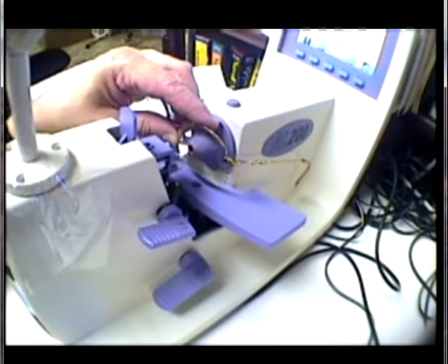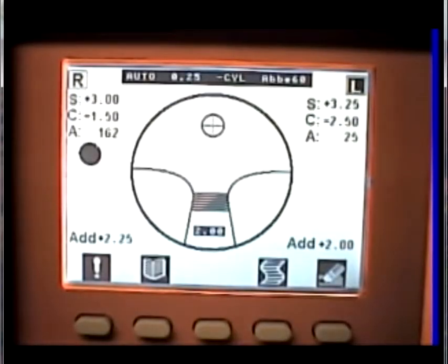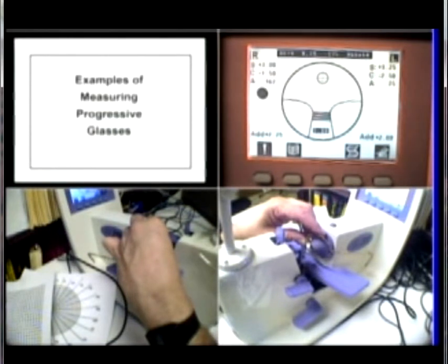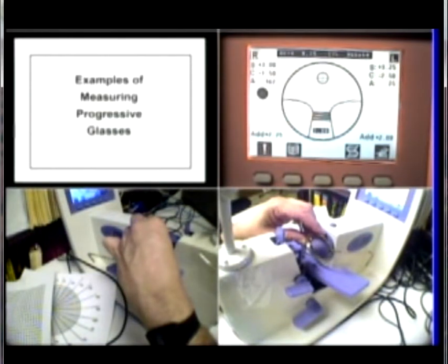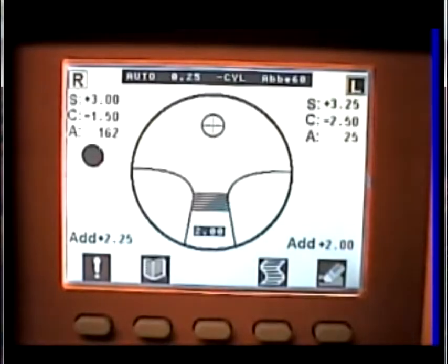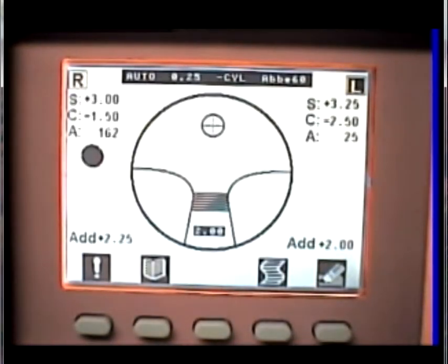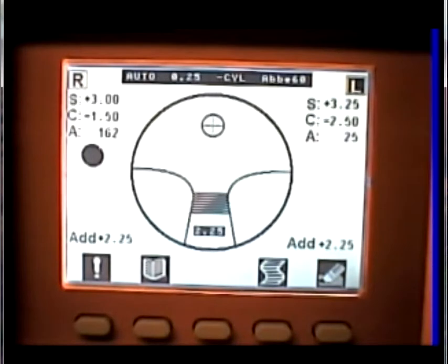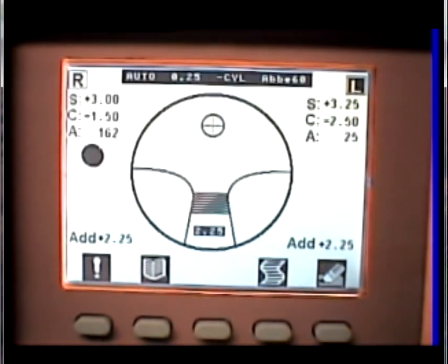Keep going up, looking for the maximum add. I'm not going to go over the edge of the glass. There you've got the 2.25, which is about as far as you can get.